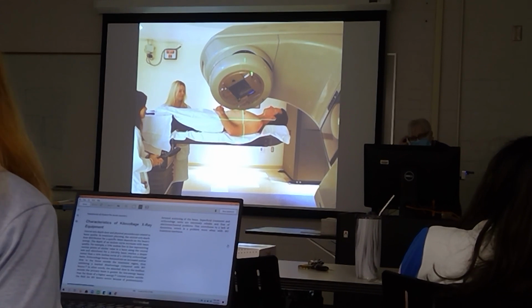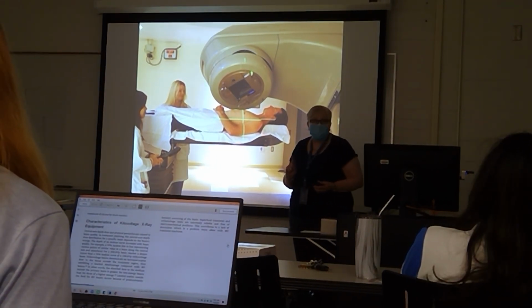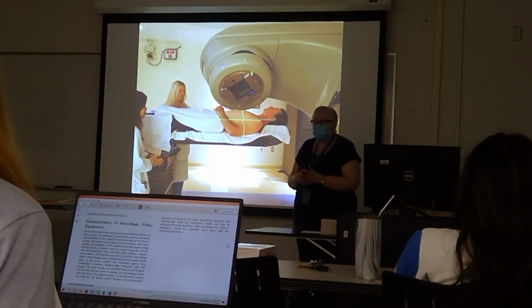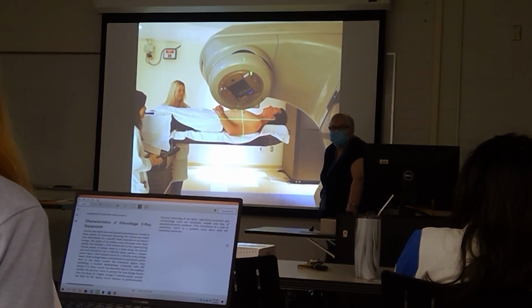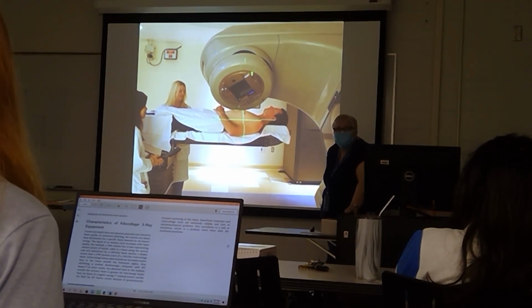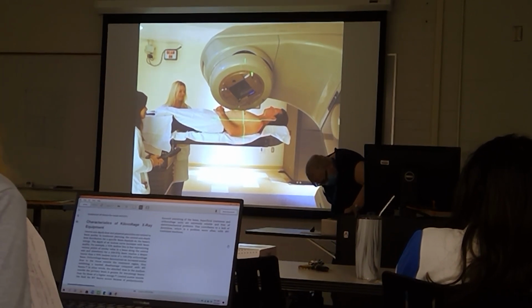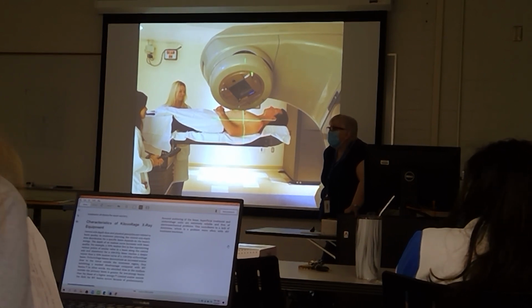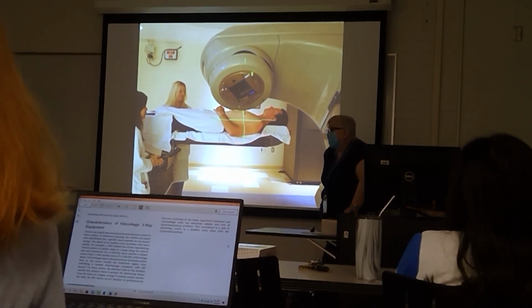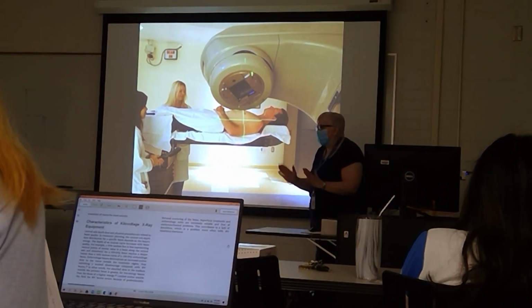So you must remember that this goes to the central axis of the beam. Tell me what the central axis of the beam is. It's the axis of the field, the light field. The center of the treatment field. Yep, the central axis. Yeah, the center, exactly. The central axis of the field.